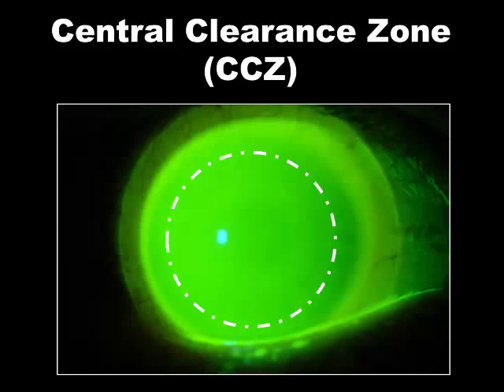Do we see this vaulting over top of the corneal tissue? With fluorescein instilled, is it difficult to make out eye anatomy? If it is, then we probably have at least enough fluorescein behind the lens. We want it to be on insertion difficult to make out the pupil or the iris. So we should have enough fluid underneath that lens to make that happen.